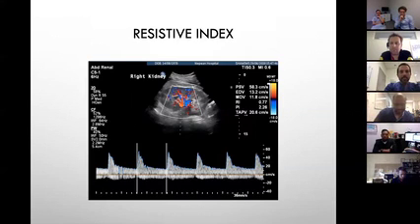Because it's a very, very tiny vessel, we're not angle correcting for the tiny vessels, are we? We're definitely not at the right angle, and we're not going to be less than 60. But try and make sure the image looks as crisp as you possibly can, to get the best borders of the Doppler trace. Is that what you try and do there?